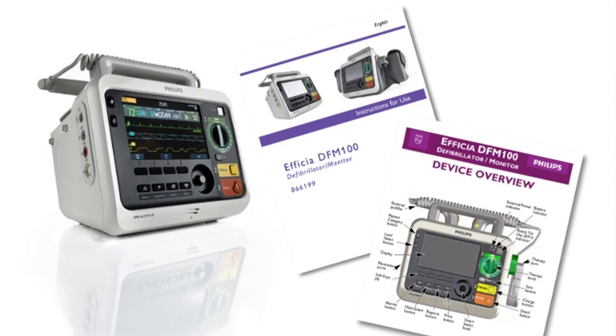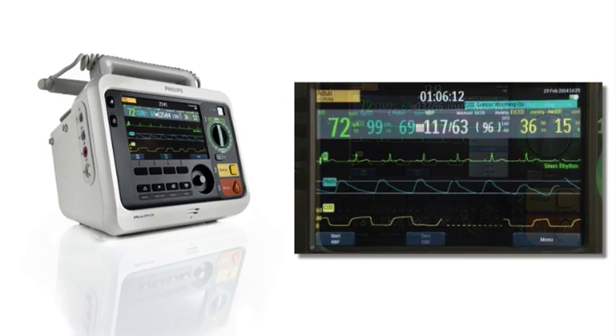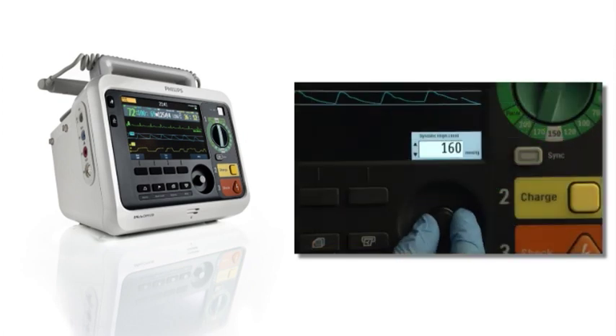In this program, we'll provide an overview of the DFM100's features, explain how to monitor ECG, SpO2, NBP, and EtCO2, and manage alarms.